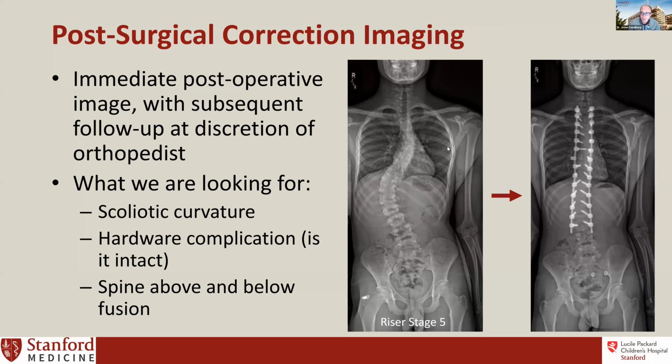Can you tell me how to know whether the X-ray is front or back, so I will know the right or left side of my body? I think this is kind of a basic question, Jesse. Sure, let me reshare my screen. That's a good question. When you're viewing your child's imaging, all the images should be marked with a label. Oftentimes as a radiologist, we view all the images backwards, like the patient is looking at me. Do you see this little R here? That's marked as the right side of the patient. So when I'm looking at it, this is the right side, and this is the left side.